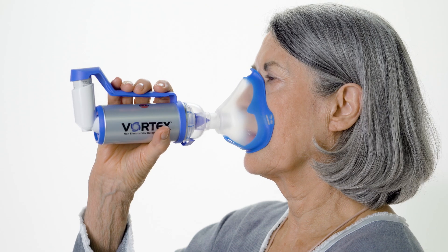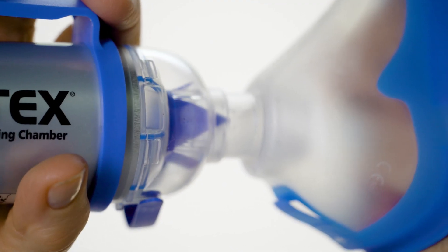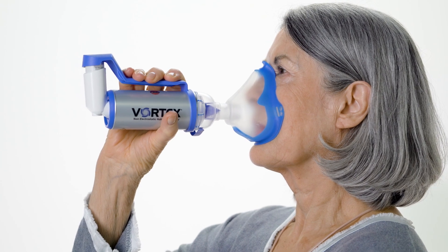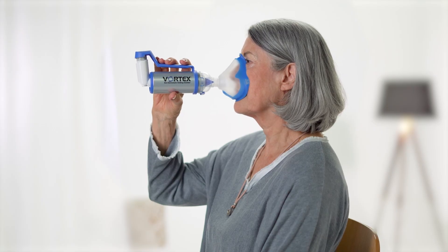When using a mask, make sure you sit upright and tilt your head back slightly. Place the Vortex with the mask onto your face. The mask should be a snug and comfortable fit. Make sure that you exhale fully immediately before use. If you have coordination difficulties or you have reduced strength in your fingers, the one-handed operation aid may help.